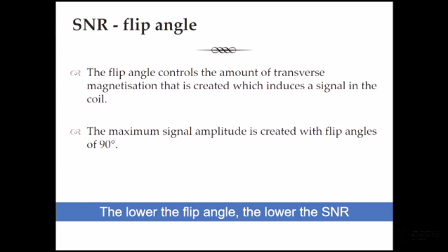If our field of view becomes larger, our pixels become larger also, and that affects our inherent spatial resolution. Some of the structures we want to look at are quite small. For instance, when we look at a study of the 8th cranial nerve, we're using a slice thickness in the region of 0.3 of a millimetre, so we're really looking for very fine structures.